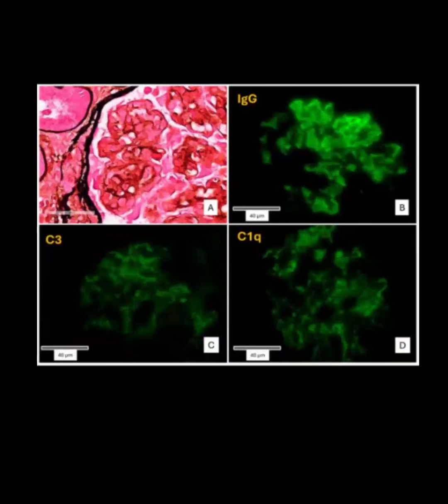So we will study in detail every topic, but can you tell me what is the diagnosis here? It is a very difficult question. Sir, this is hyalinosis? In the slide there is double contouring, a thickening with double contour. It is MPGN. Okay, so it is IgG positive.